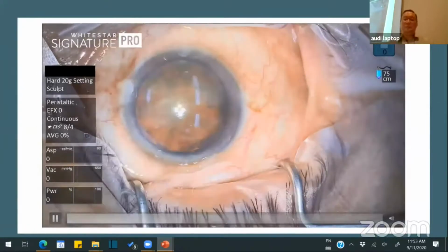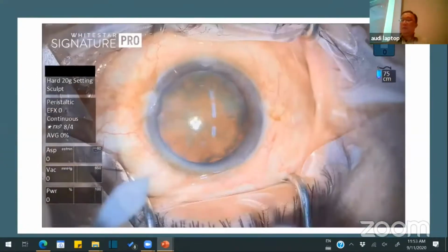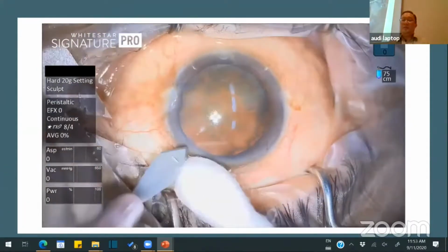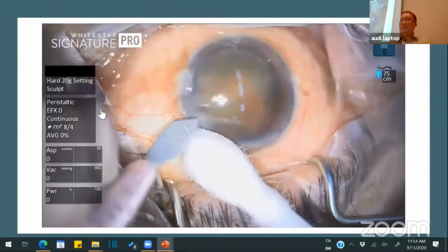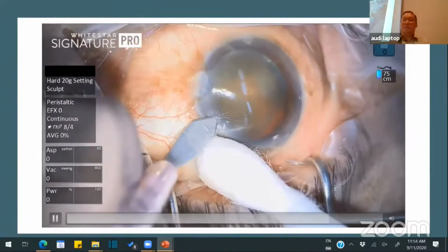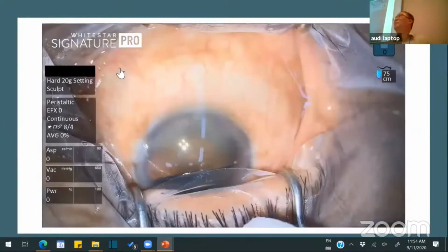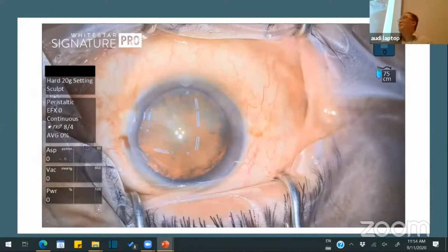Okay, this main wound. So this is the second part. First of all, it's two anterior. Brilliant. This is two anterior. Okay, struggle, pressing, struggle. And took too long. So patient look up. So you end up having a big wound. Could you all see? It's a big wound, as big as 2.75 wound.